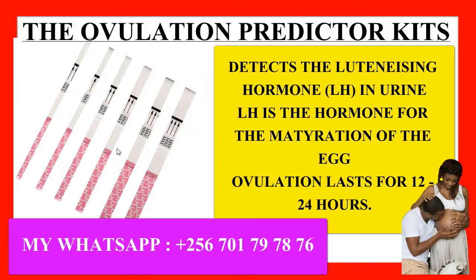So remember, we said that when the test line becomes very dark, that is a sign that your ovulation period has reached. Normally it lasts for 12 to 24 hours. So if you are looking at getting pregnant, it's advisable to have sex when the line is darkest.